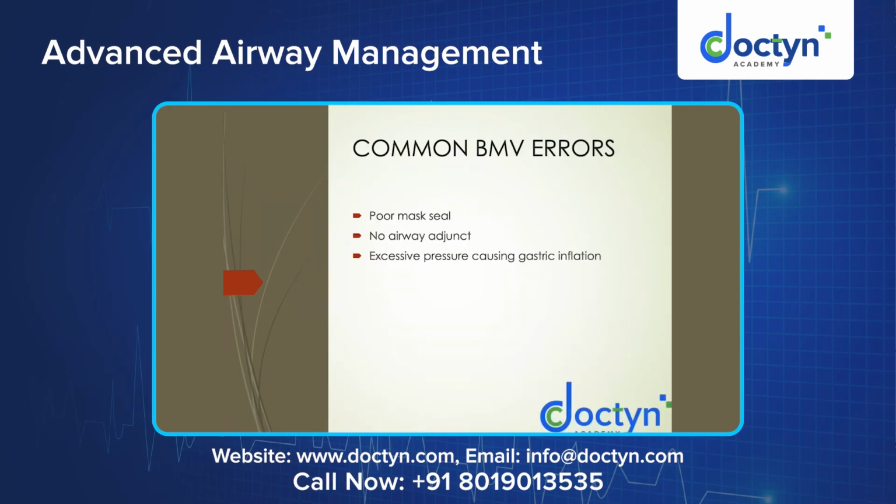As we said, the poor mask seal, even though if we give a good jaw thrust, but the mask seal is not adequate, this will lead to inadequate bag mask ventilation. Or in an obese patient, a very heavy jaw patient, or a big tongue injury who has a tongue edema, even if we are putting good jaw thrust and good seal, there will be inadequate ventilation because of an unpatent airway. So in those patients, again, you will have to put an airway adjunct, which would lead to opening up the airway, maintaining the patency of the airway, and continuing ventilation improves oxygenation of the patient, and you'll be able to save the life of the patient.